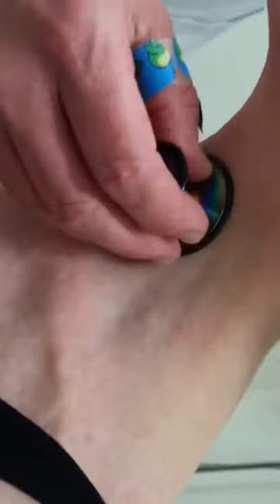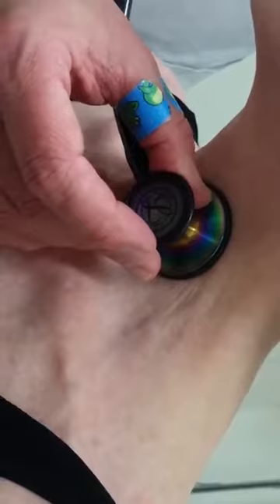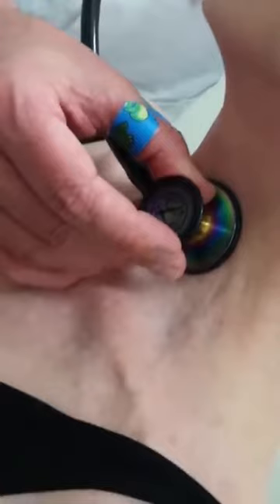You will then go to the other side, having the patient turn their head slightly towards you. Find again the sternocleidomastoid, going just medially to that with gentle pressure — remembering we do not want to massage the carotid. Ask the person to take a deep breath, have them hold their breath, and then auscultate for the carotid bruit.